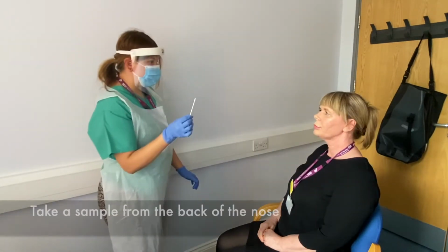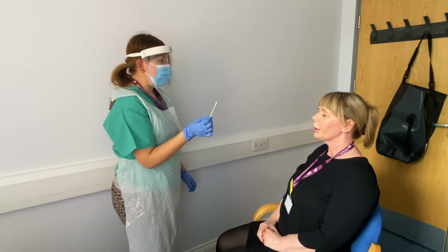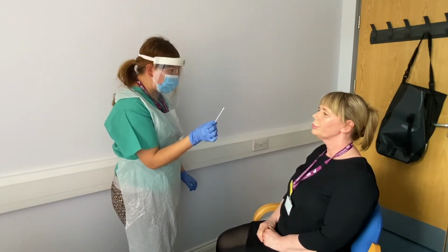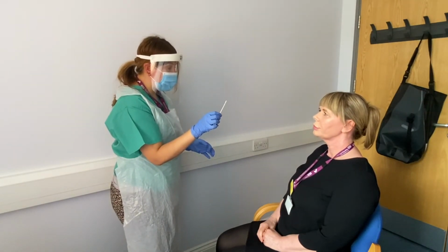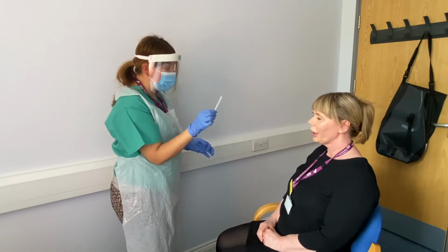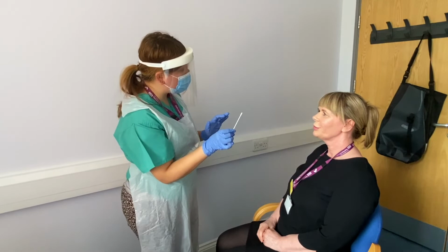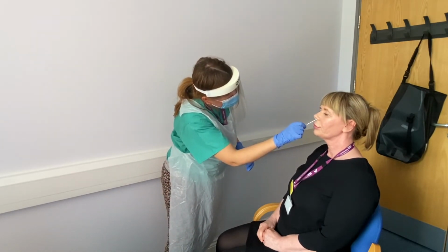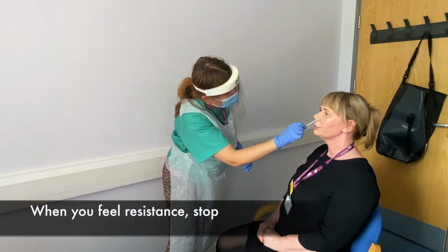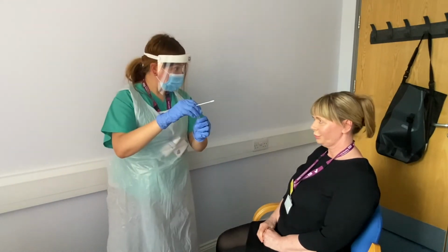Very good. So now we're going to take a sample from the back of your nose. Okay. This doesn't hurt, okay? I will rotate the sample and go as far as I can go, but without giving you any pain. You might feel like you want to sneeze, and that's okay. Rotating. And then the moment that you feel resistance, you stop. That's it, that's done. That's all done. Thank you.